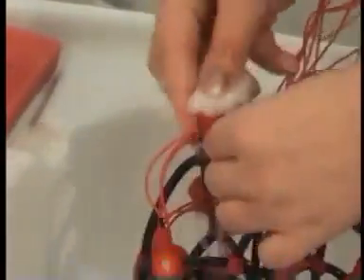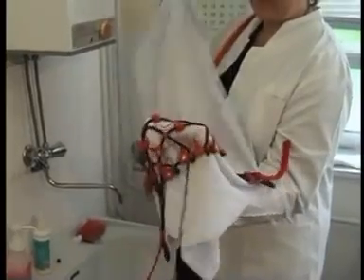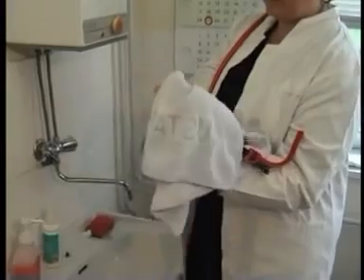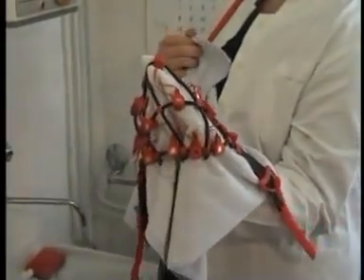Make sure there is no dried-up gel on the electrodes because it creates a high resistance layer which prevents testing. Use only cotton wool sticks soaked in alcohol to clean each electrode from remaining gel. Sterilize the caps with gas when needed. The electrodes should be maintained according to manufacturer instructions.